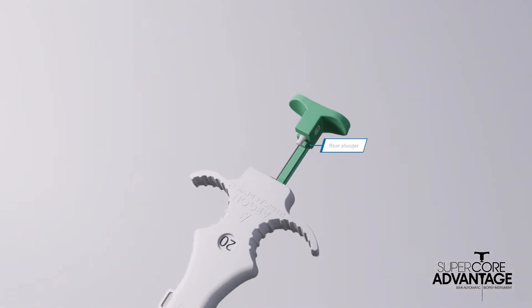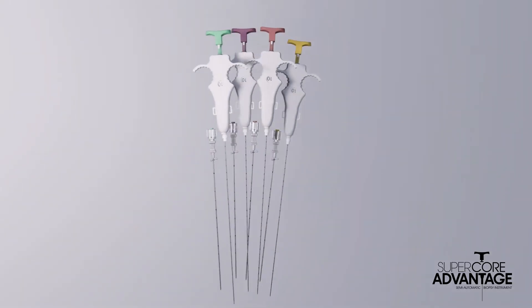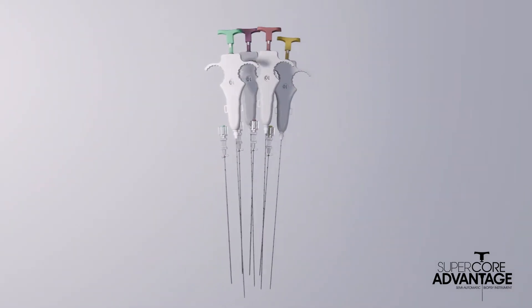When it's time to deploy the instrument, the rear plunger is ready to fire on demand. SuperCore Advantage is offered in a wide range of needle lengths and gauges, with the corresponding set of coaxial introducer needles.